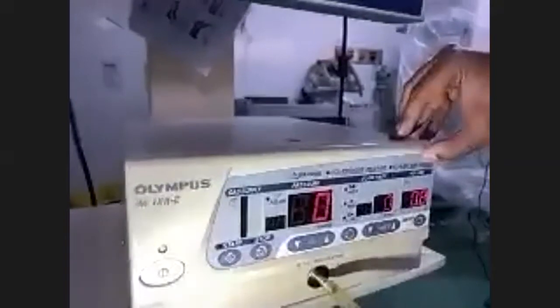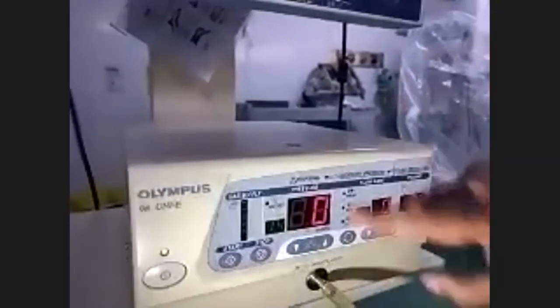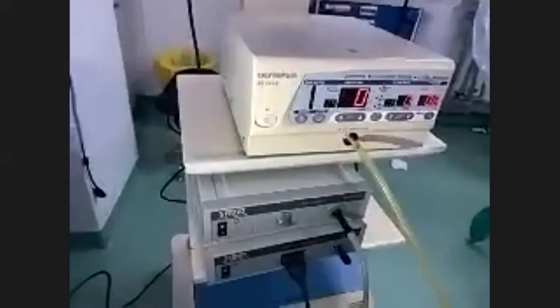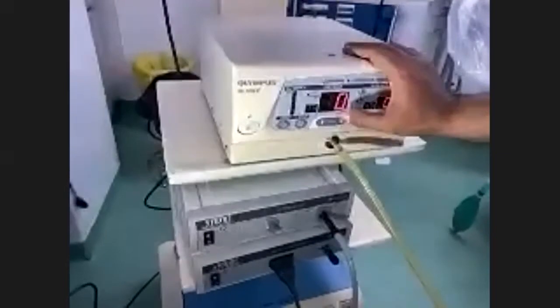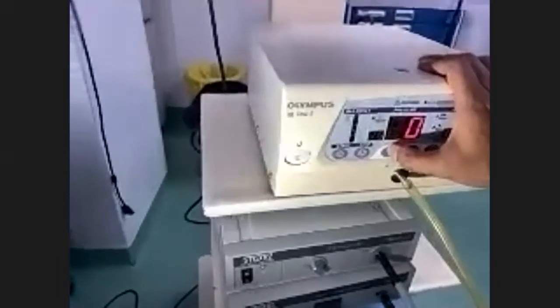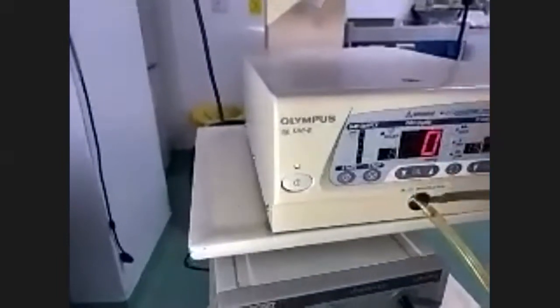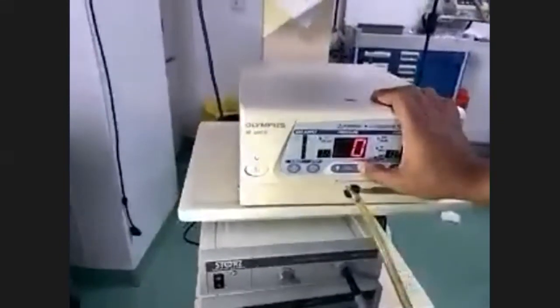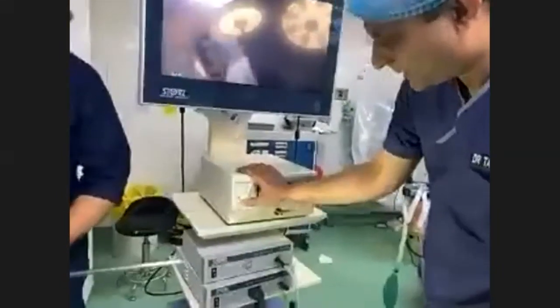And I have told you, if the tube is obstructed or if the valve is obstructed, these values will go up. And if during the surgery there is some cardiac problem or the anesthetist requests that you do not have more pressure, then you can just reduce the pressure like this, up to 10, 9, 8, okay? And you can increase it from here as well. And this is a switch on and switch off button, right? This is how to use it.